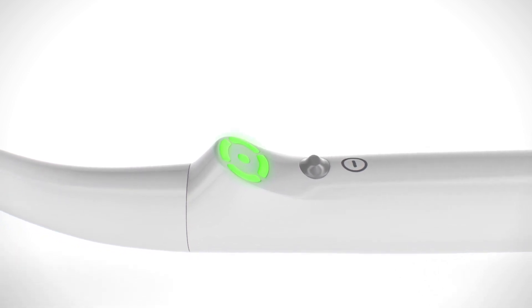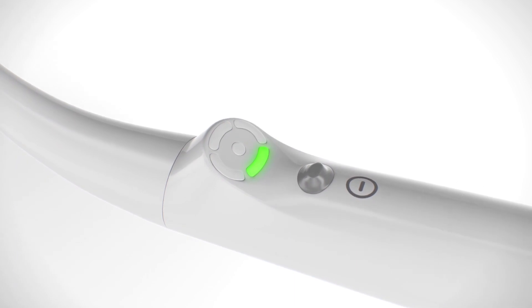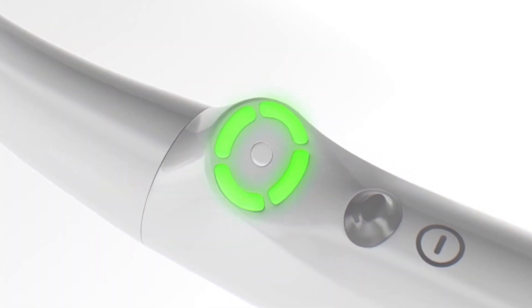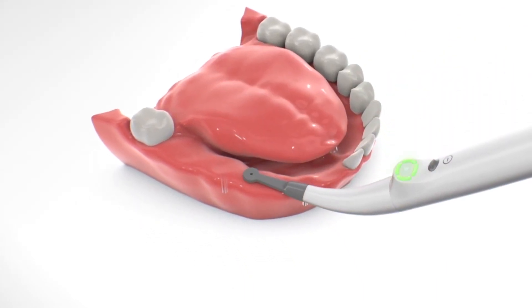One short beep indicates that audio feedback is enabled. The device performs automatic calibration. When calibration is completed, four segments blink green, indicating that the device is ready for operation.